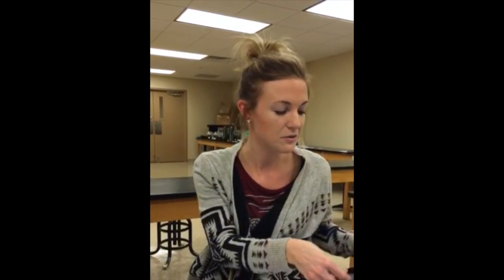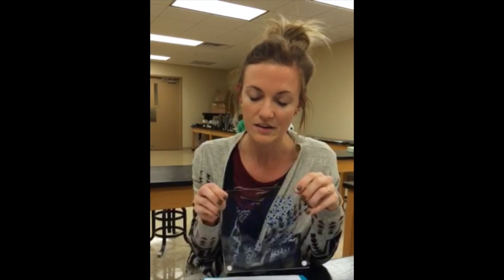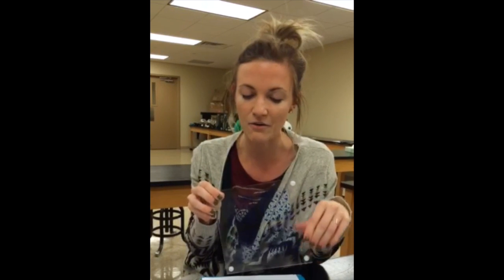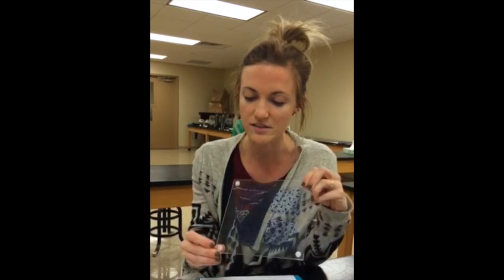So the way this works is that each stereo plate has 4 blocks on it, and this one is 0.15 centimeters thick, and each block has a different depth plane, or one of them has a different depth plane than the others, which makes it easier to stand out. And so the person presenting the stimuli knows which one based on this. There's a little knob that they can feel. And so we know that the box down in this corner has the different depth perception.